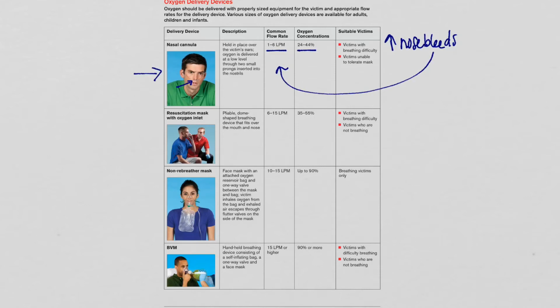Let's back up a little bit and say that what we breathe in terms of CPR and rescue breathing, what we can breathe into the patient is approximately 21% oxygen. So when we breathe into our patients, what we are breathing into them is approximately 21% oxygen in terms of oxygen concentration. So we can see that the nasal cannula is going to deliver just about that, or maybe even 2 times that rate. Either way, we're getting them more oxygen than they're capable of getting if they are hypo and or hyperventilating.